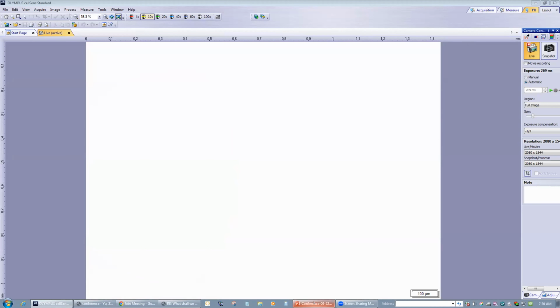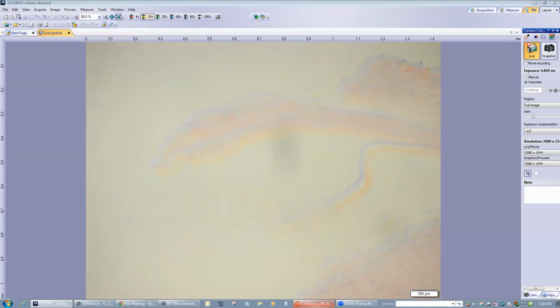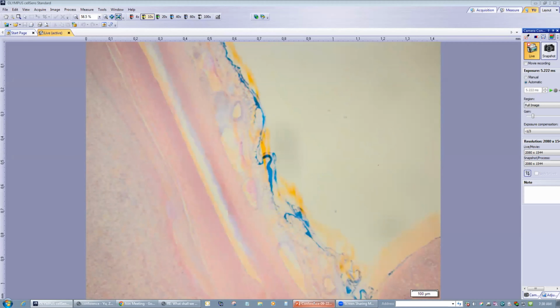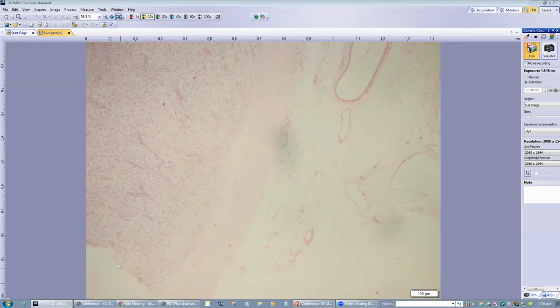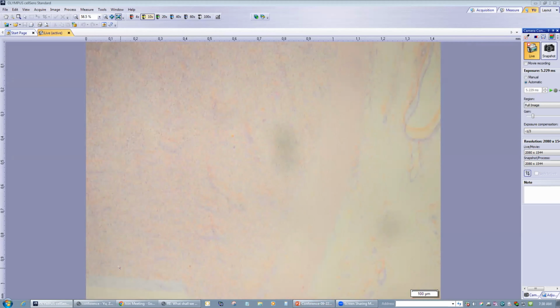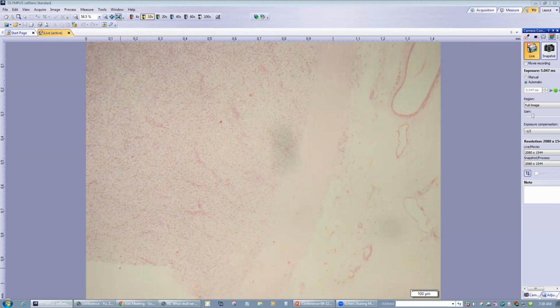3-year-old. Let's see if I have normal kidney. Okay, that's normal kidney capsule. That looks like a hilar area, with a big vessel and some fat, so that's the renal sinus area. That's normal kidney, and then here's the tumor. This tumor seems to be partially encapsulated. That's pink, partially encapsulated, and that's the tumor.